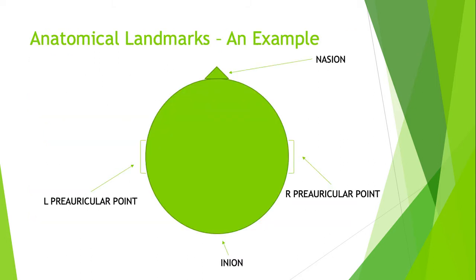To serve as a simplified example prior to the instructional video, these 4 important anatomical landmarks are shown in this slide in a top-down bird's eye view, as if you were looking down at this individual's scalp. The Inion can also be observed as the external protuberance at the base of one's skull. We will use these 4 distinct landmarks to identify the proper positioning for our 6 exploring electrodes.